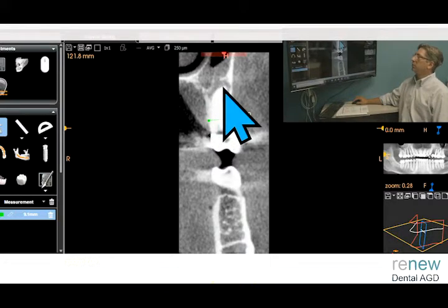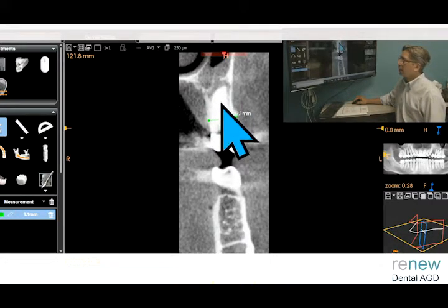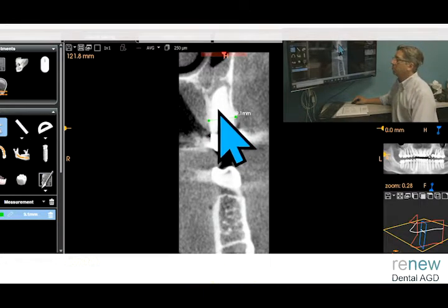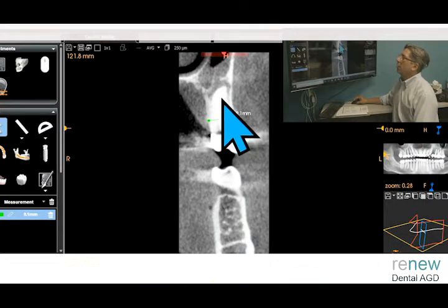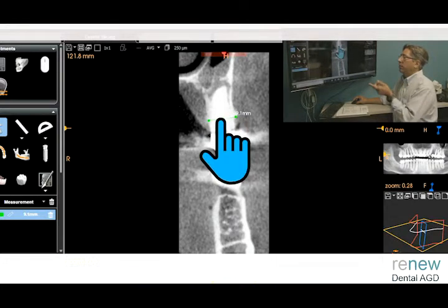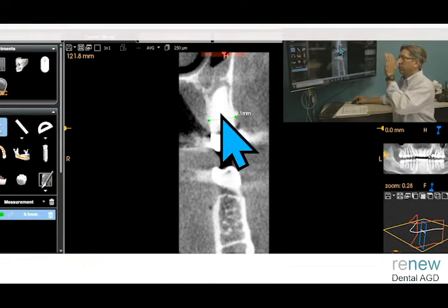If it feels pretty good, I will take a smaller blunt end instrument. I wouldn't take a perio probe, and I wouldn't take anything pointy like that, but something fairly blunt. And I want to feel that it feels kind of like a rubber band. I have some sinus tools. Sorry, I can't remember the name of them.